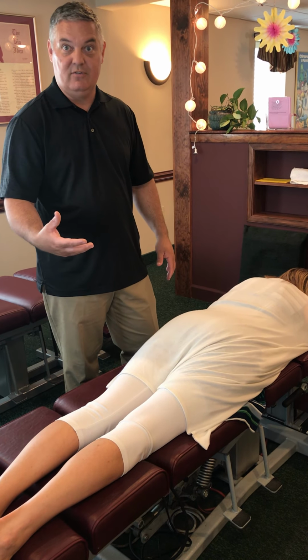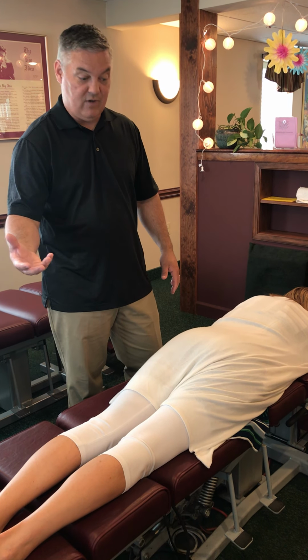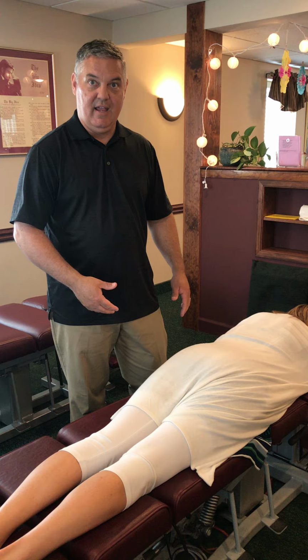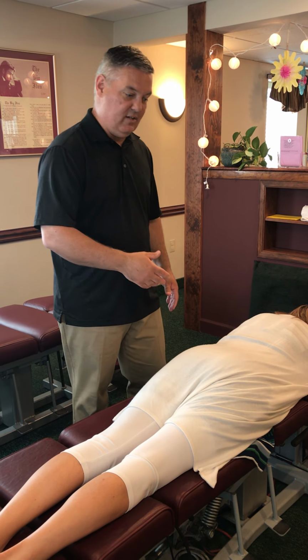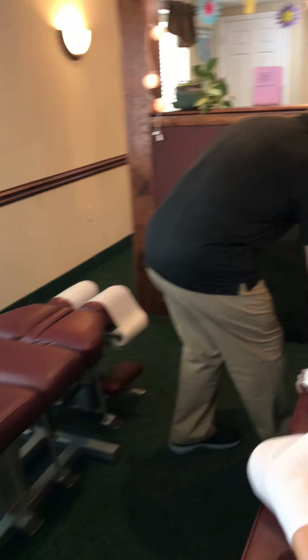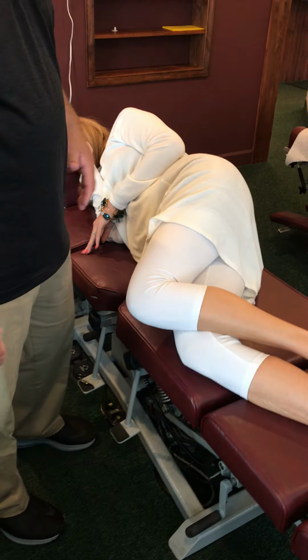One is the drops, and that'll be listed as a drop, lumbopelvic drop. Number two is we do something called a side drop, and the side drop is essentially putting the patient on their side. So have you lay on this side, turn and face me this way. And as it sounds, it is a hybrid of a side posture and a drop.